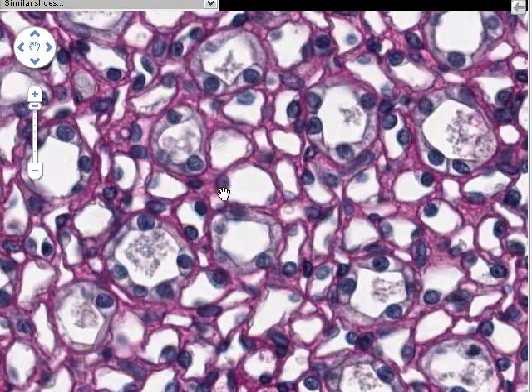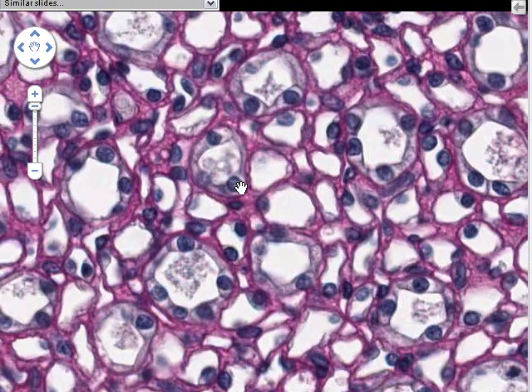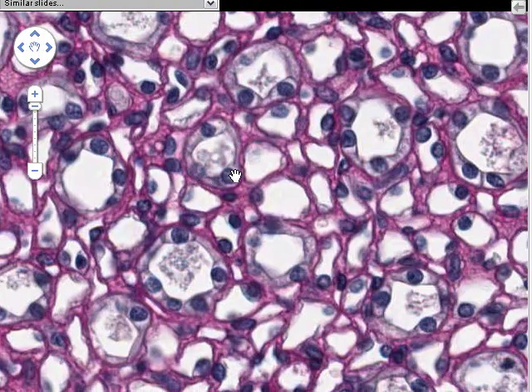And then as we look here we've got basement membrane, we've got lumen, and in this particular one we can see a nucleus, so it bulges into the lumen, but we can't really see any cytoplasm that belongs to this cell or any other cell that might form part of the wall of this tube. So I would be inclined to call this one simple squamous. If we look over here, here's a good example. Here's a nucleus, and we can see some cytoplasm from this cell stretching out and stretching over in this direction as well. This cell is obviously longer than it is tall, so again I would call this squamous.